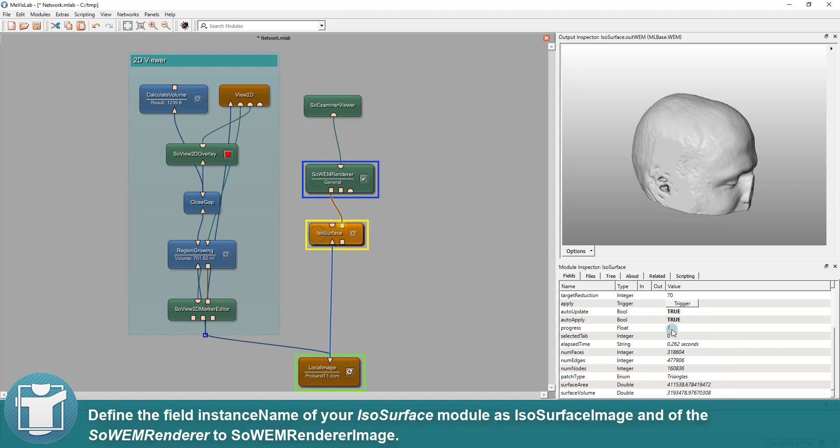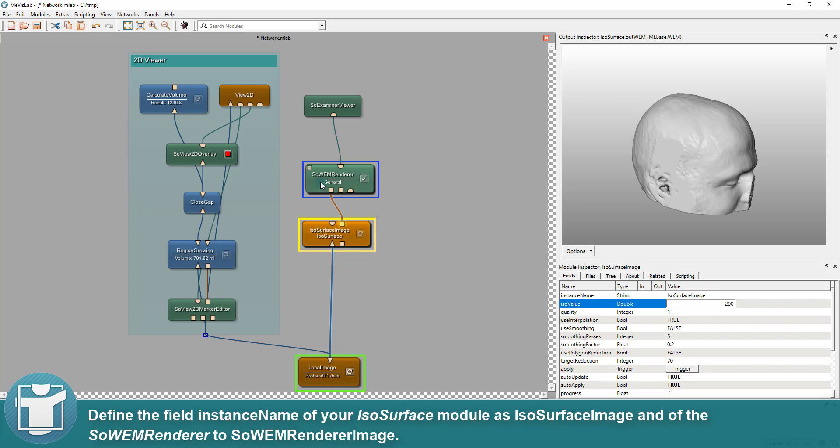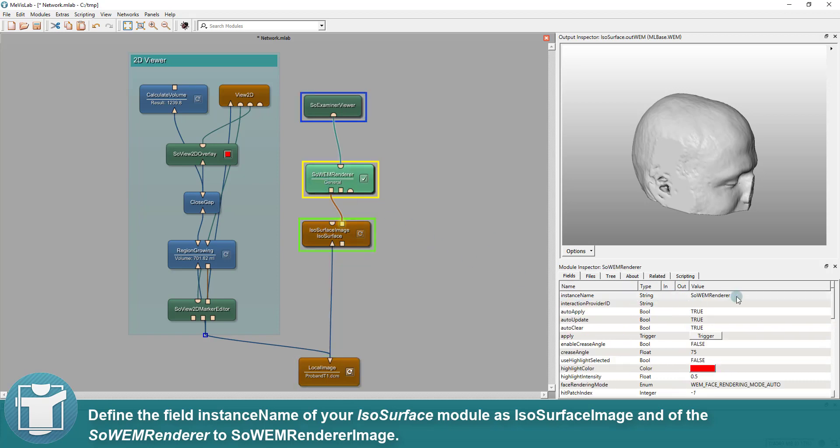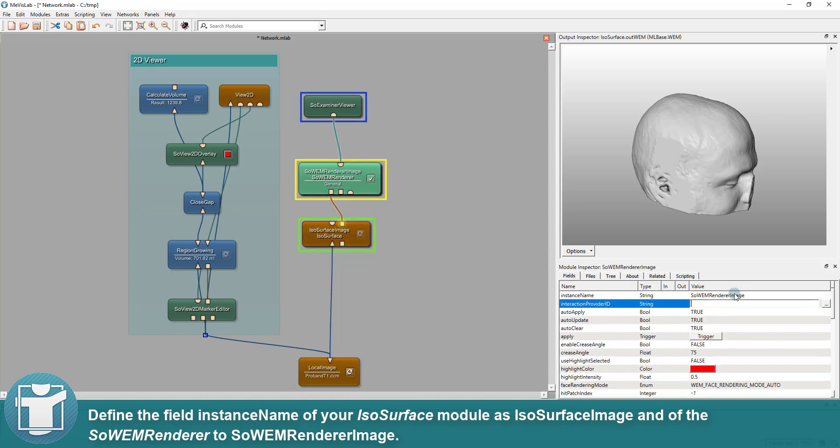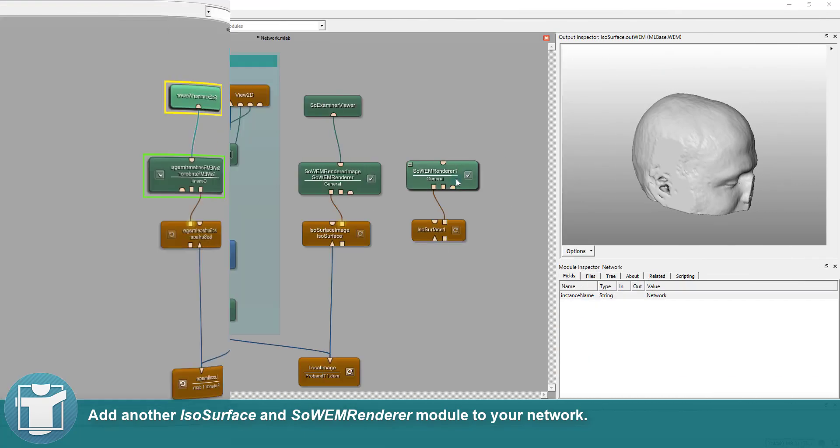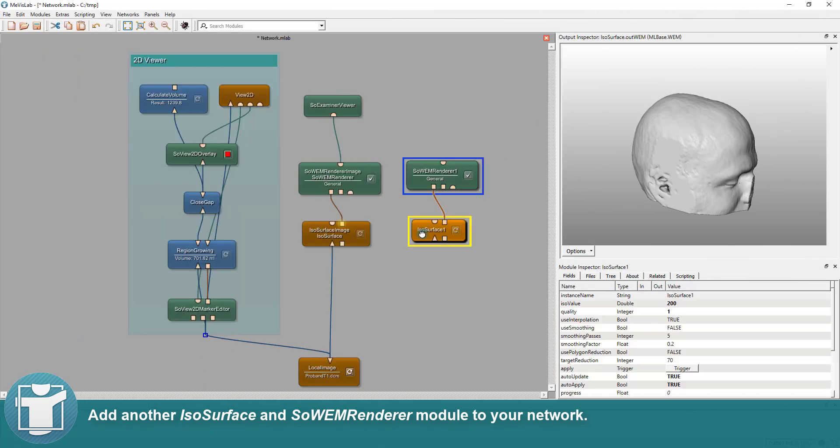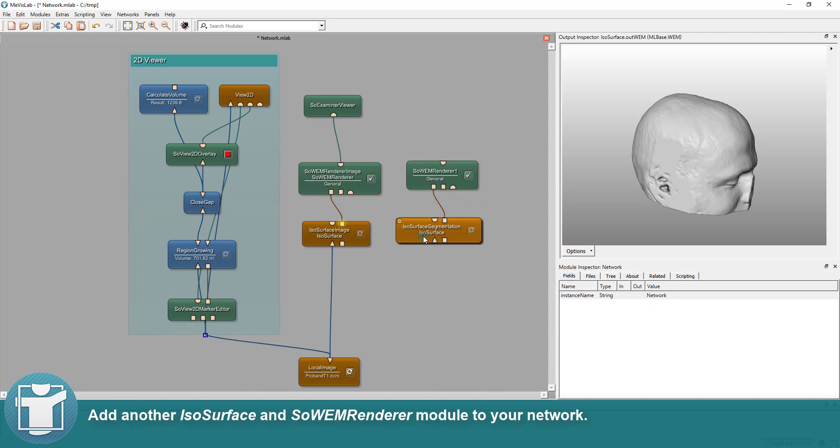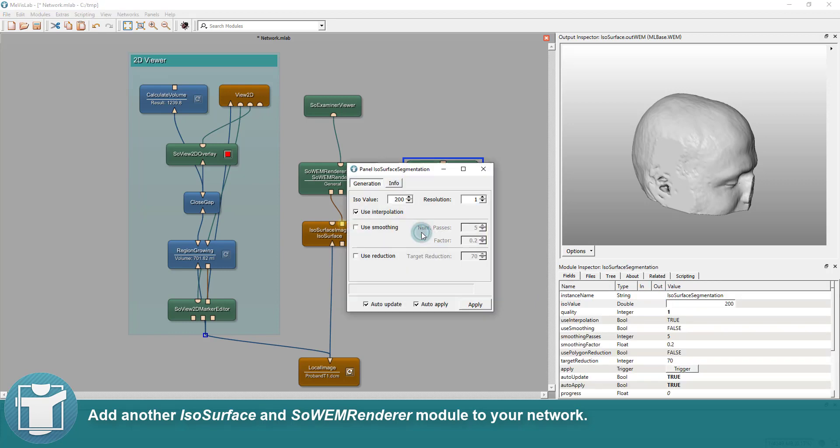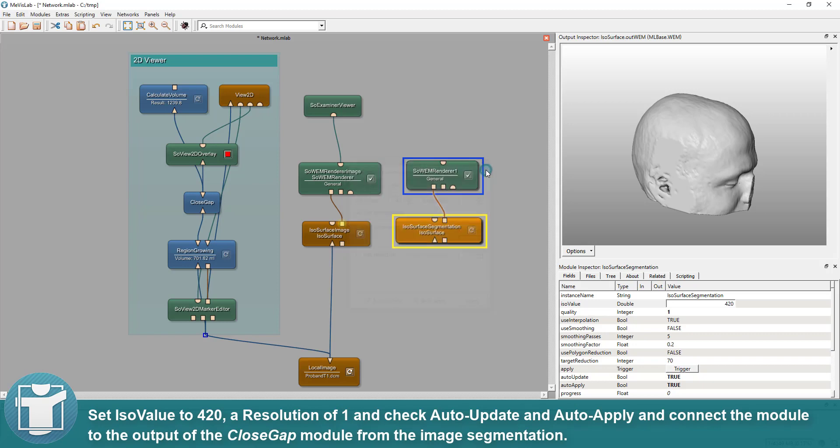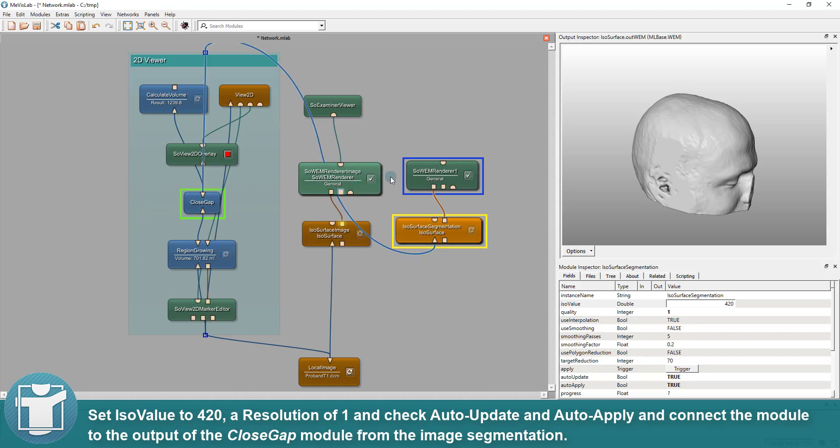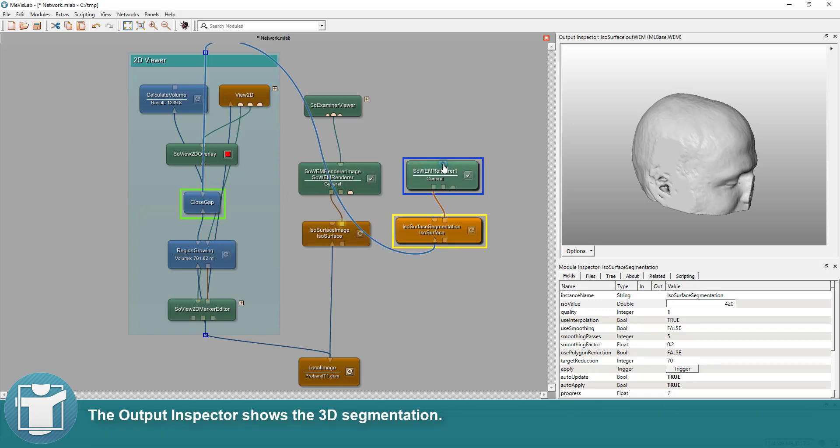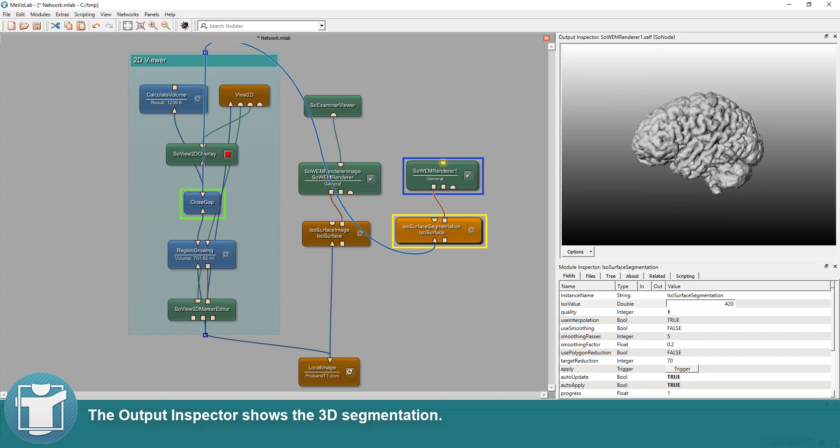Define the field instance names of your ISO surface module as ISO surface image and of the SoWEM renderer to SoWEM renderer image. Add another ISO surface and SoWEM renderer module to your network. Set ISO value to 420, a resolution of 1 and check auto-update and auto-apply and connect the module to the output of the close gap module from the image segmentation. The output inspector shows the 3D segmentation.